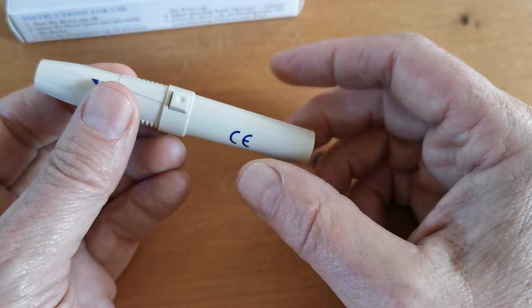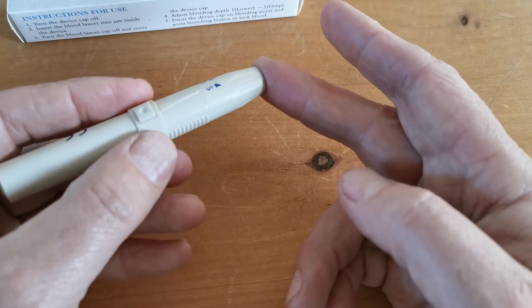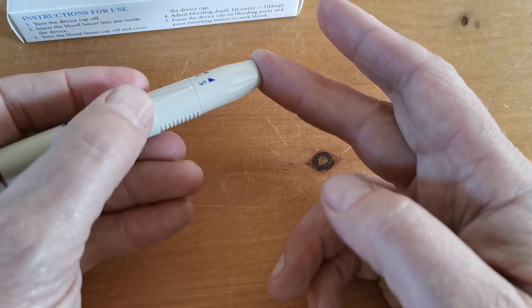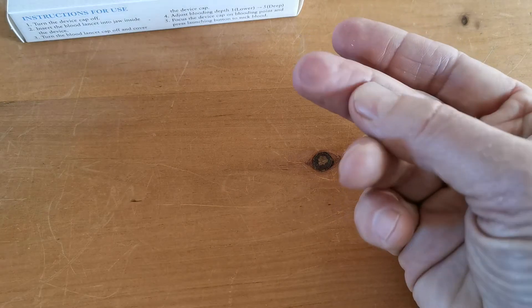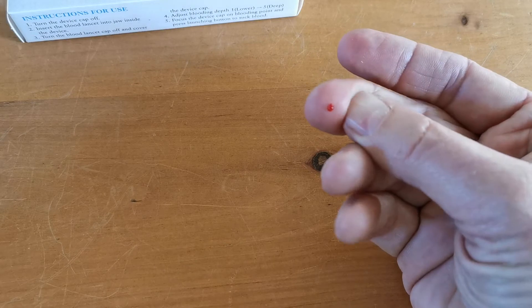I haven't used that, so I can reset it. The mechanism for testing is to simply apply this gently to the end of a warm fingertip and press the trigger. That's it — lance done. There you go, to prove the point. That was on a five, it's a nice deep lance.